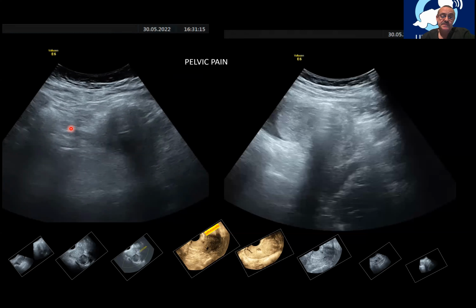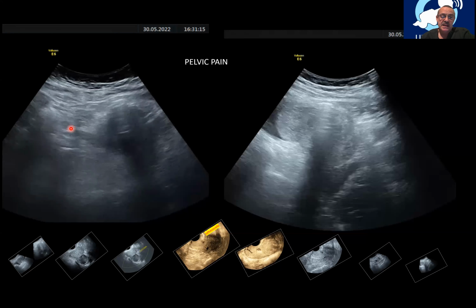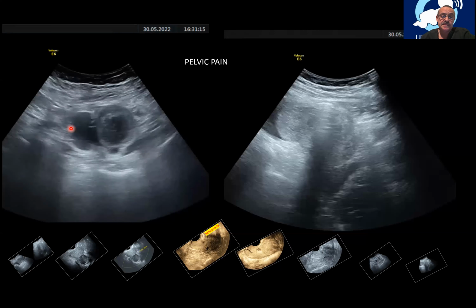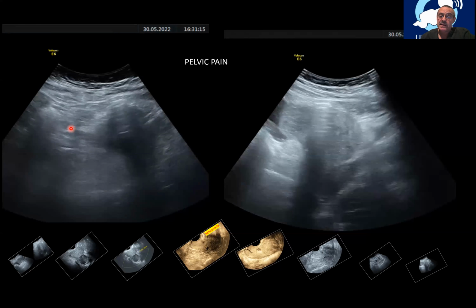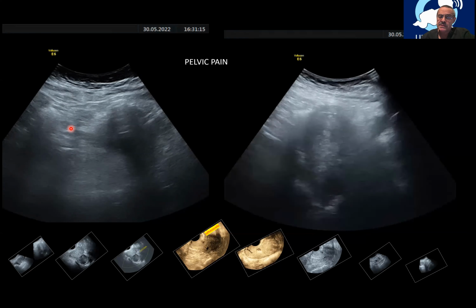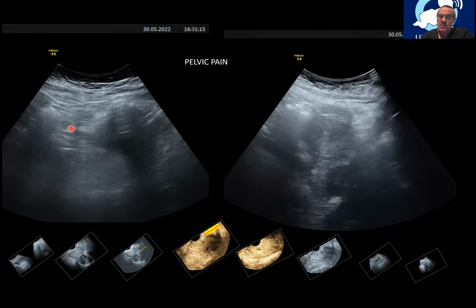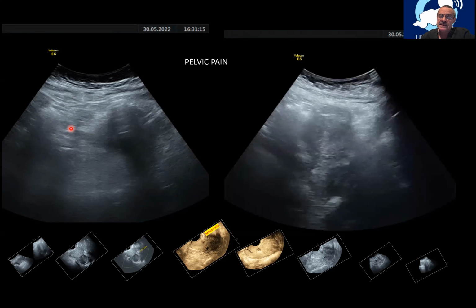Again, that was a complex ovary. Again. Okay. Else, the ovary, the uterus, and something in the uterus. Something really small. Let's see how we can improve that. Improve the diagnosis.